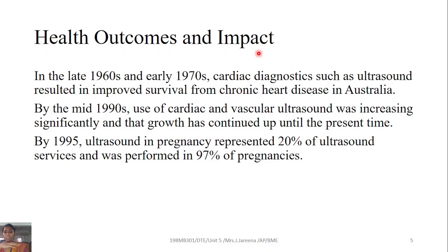So if you give the right treatment, the right diagnosis and the right medicine at the right time, the success of the treatment will be high. So in the 1960s and 1970s, cardiac diagnostics with the help of ultrasound showed very promising results. By the mid 1990s, the application slowly focused on cardiac and vascular ultrasound, to see the blood volume, not only in the heart but also in the blood vessels, to identify any blood clots or other problems in the blood.